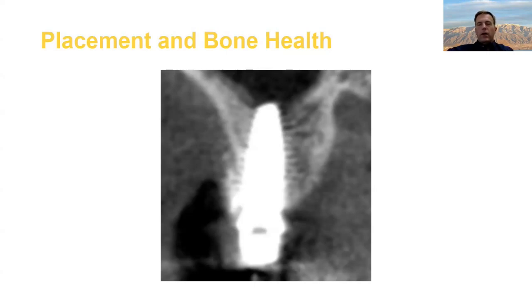One other thing about implant placement that's good to know is that when you're placing an immediate implant, studies have shown that you want to have 4 threads at least into the bone apical to the extraction site to make sure that you get nice stability. This is why sometimes you wind up placing really long implants. We'll talk about why it doesn't really help from a load resistance perspective, but sometimes we need to do it just to get into some nice sturdy bone to get that primary stability that we need.